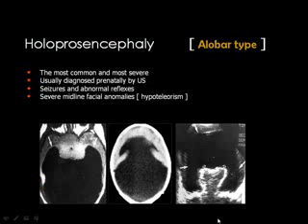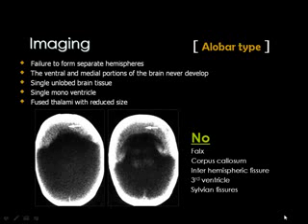And this is an easy diagnosis, even intrauterine, either through the transcranial ultrasound after birth, or even in utero by the transabdominal ultrasound. Then if you see this characteristic configuration where the ventricles are represented by a single bag filled with water, then you know that this is the holoprosencephaly alobar type.